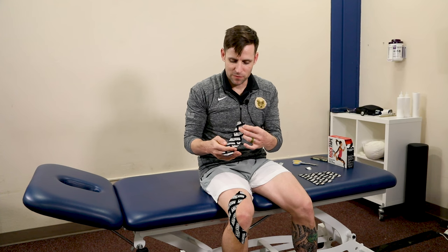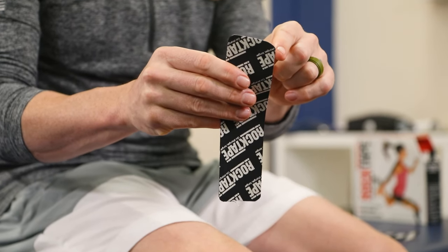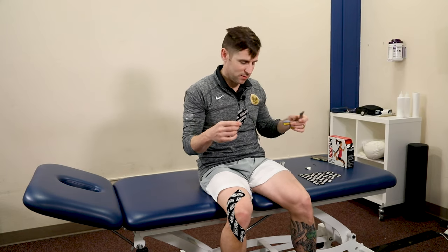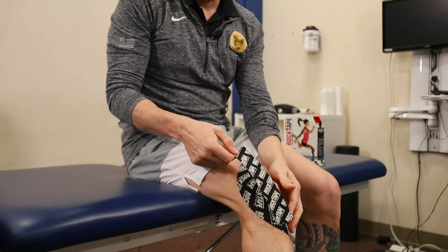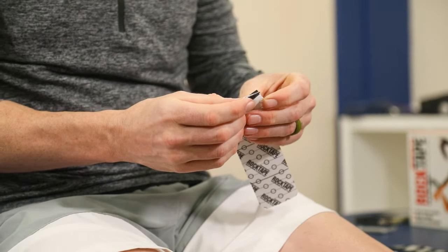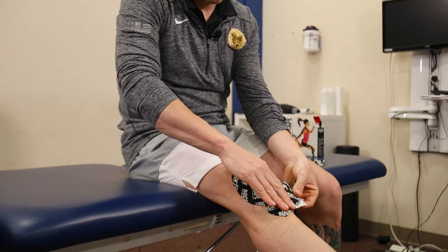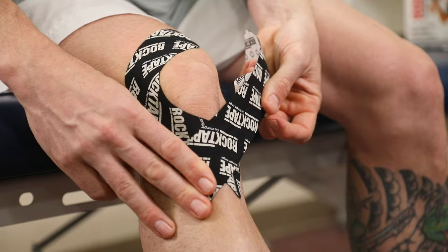One thing I always do right before is make sure we don't have squared sides — if it's squared, it could rub on something and come off. So we're going to round the sides just with a pair of scissors beforehand. Remember, when you make a cut, it doesn't have to be as long as what you want to tape, because the tape will be longer than the actual piece. So again, we're going to straighten it out and come around the opposite side, slowly applying a little bit of tension.